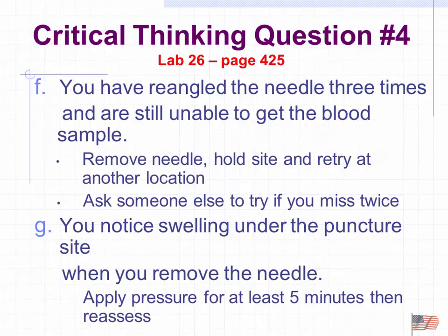You notice swelling under the puncture site when you remove the needle. Yikes! That's where we got a hematoma. You got blood leaking out. We want to apply pressure. We probably will apply pressure for longer than a normal five minutes.